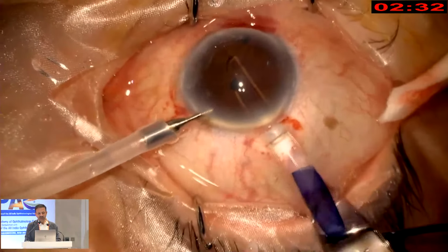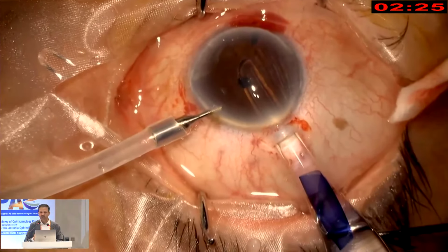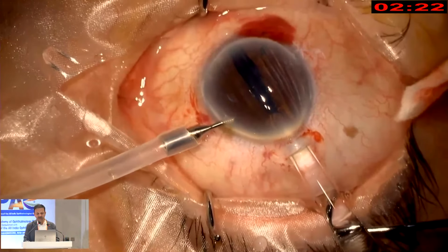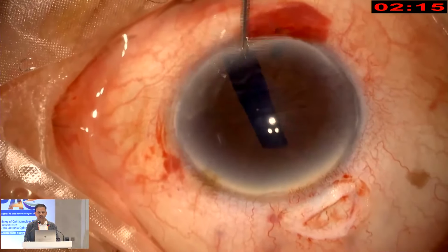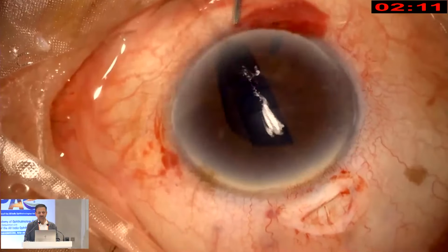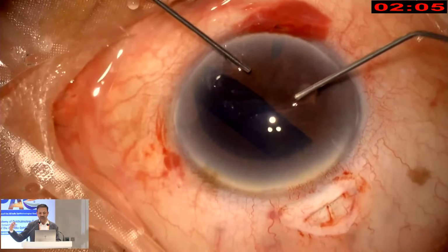We put in the tip of the cartridge into the eye, rotate, so the open end of the scroll is facing towards the surgeon. At this point of time, the AC maintainer is disconnected, but see how easily the scroll goes into the eye without any tendency for the scroll to open up. And as you just tap on the surface, you can see the scroll is opening up, one edge is already open. You move it to one side to create space on the other side.